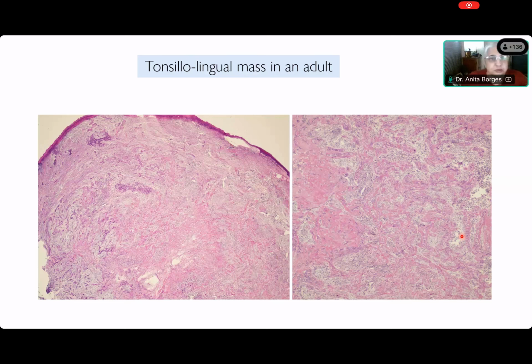Okay. Now, what do you see at low power now? Do you get some impression? I don't want you to tell me about the cells or anything. What should you be doing at low power? Whenever you look at low power, what kind of impression should you get, Somik? The pattern or the architecture? Yes, the architecture. Very good. So, in other words, it's a pattern. Now tell me, what is the pattern that you're seeing?